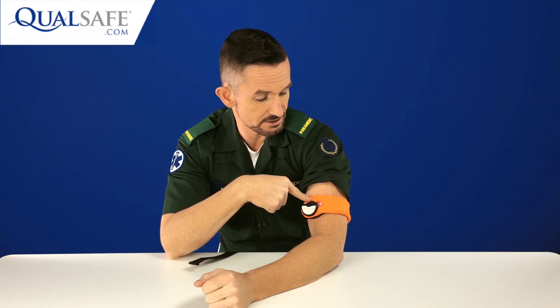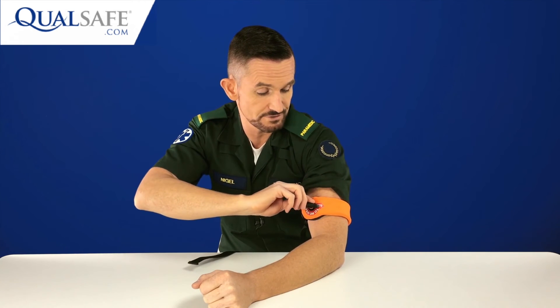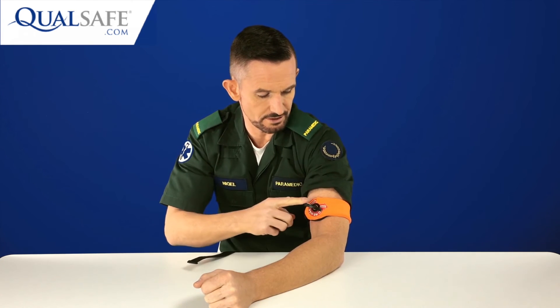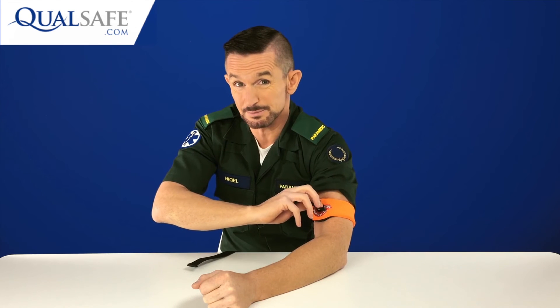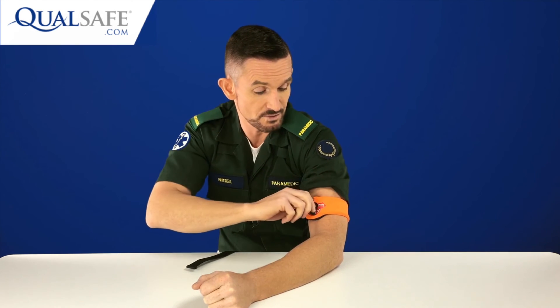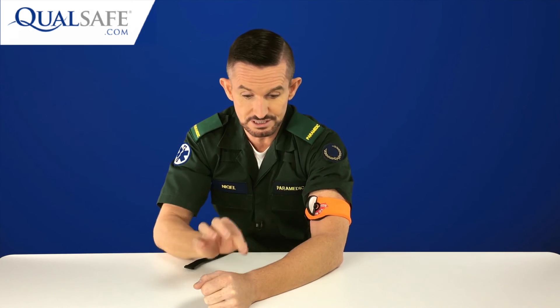To tighten the MAT, the absolute fantastic feature is its pulley system inside. All you do is twist a small dial to tighten the pulley system — very easy to tighten with just two fingers. You tighten it enough to stop the life-threatening, pulsating bleeding. If you need just a little more, you can add a couple of extra notches to get the perfect pressure — unlike the CAT or SOF-T where you'd need a full half-twist each time.